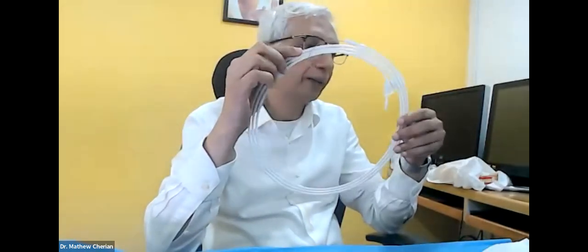So to summarize, we got a J wire, which is a safety wire. It is a stainless steel core wire. It kinks, has very little use except access. Then we got the nitinol wires, which can be angled or straight, which are very torqueable, which is the most popular wire in the lab, used for recanalization and also for super selective catheterization. Then for support, we got the extra stiff, the super stiff, and the Lunderquist wire, which is the father of all wires when it comes to stiffness, right? Okay. Just wanted to show you another small thing before we go.